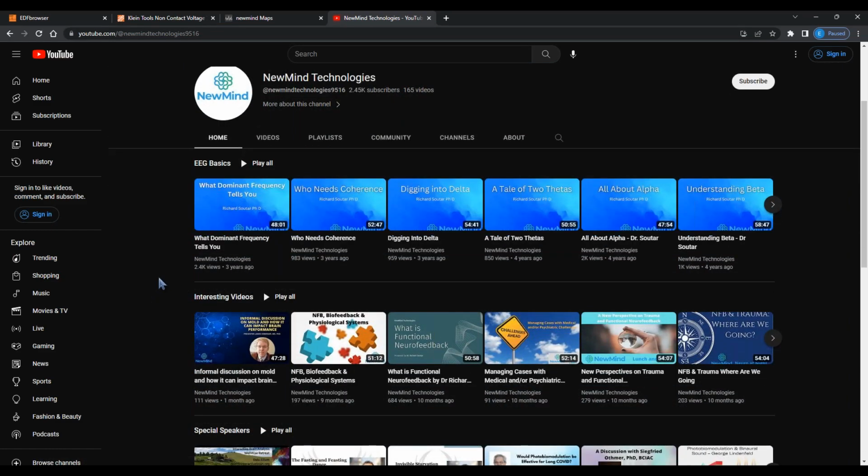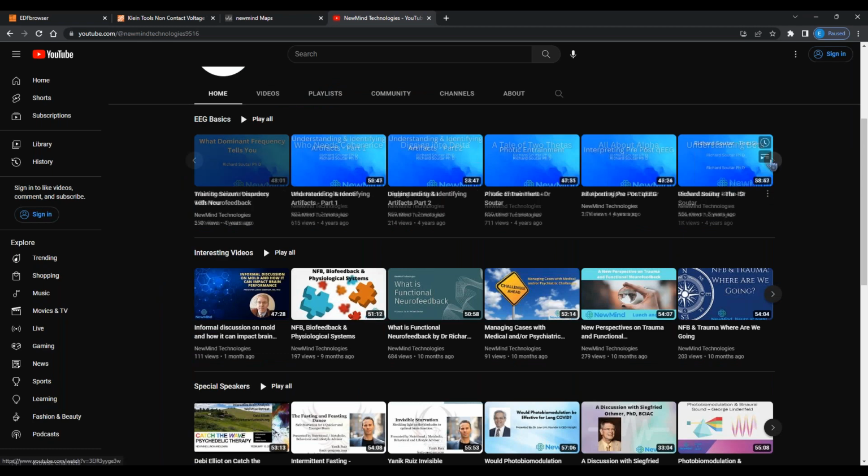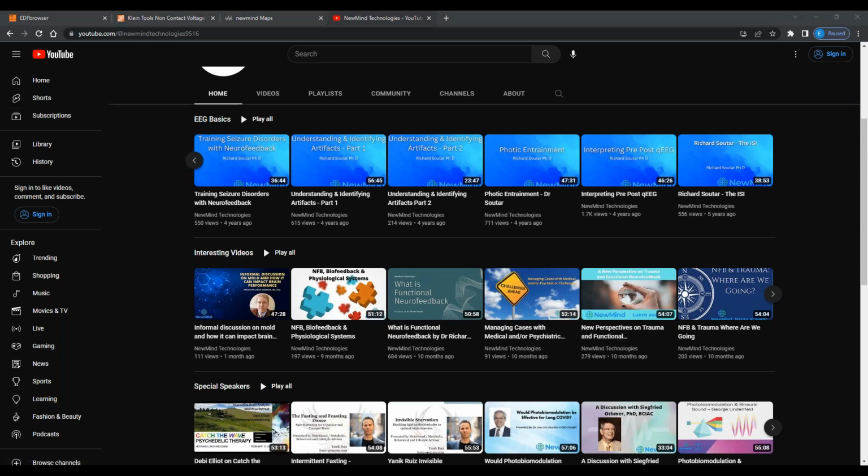But if you guys do download this, go to the help section. They've got an online manual, and they'll spell everything out for you on how to do it, what it does, and how that's going to affect your signals. So definitely look into that.